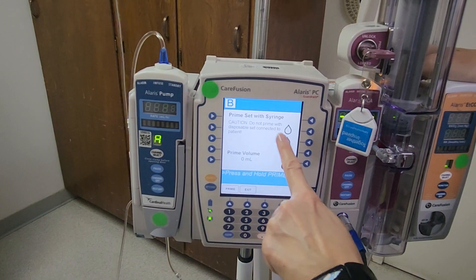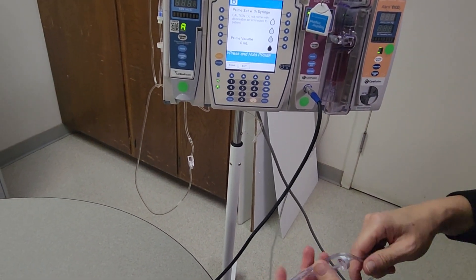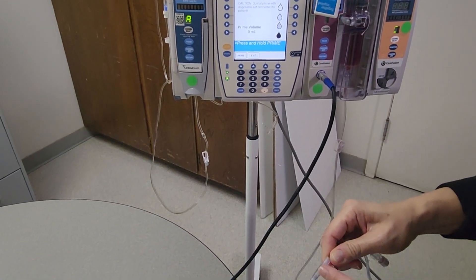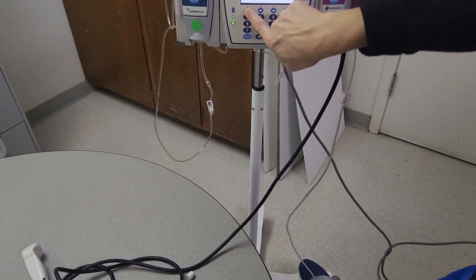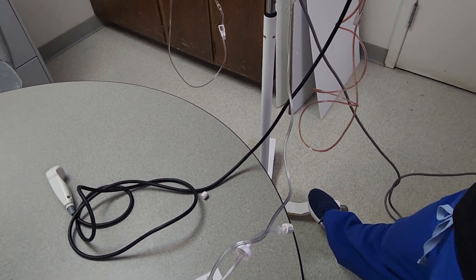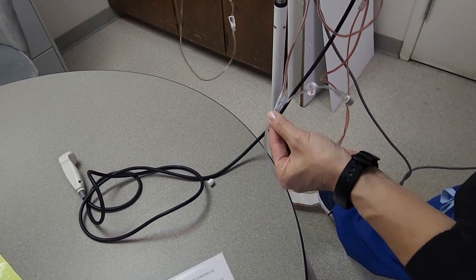The prime button is here. Press and hold until you see the fluid come down to the point where the tubing Y is, right about there. Watch where it's at — a little bit more — until it's almost reached that point and arrives at the Y.